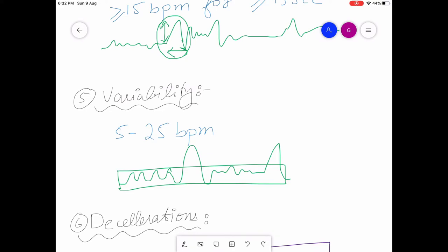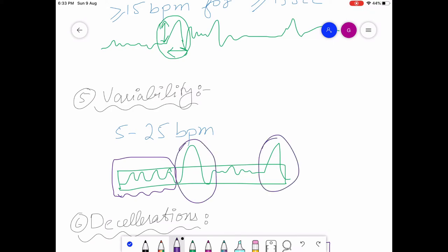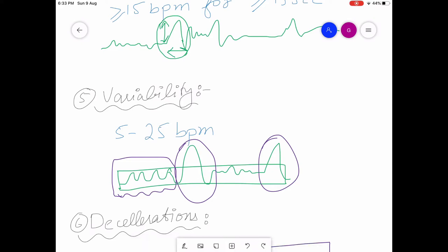Variability is the fluctuations in the baseline fetal heart rate that are irregular in amplitude and frequency. Normal variability is 5 to 25 beats per minute. You must exclude the accelerations and decelerations when measuring it. Variability should be assessed over a 10-minute window period.